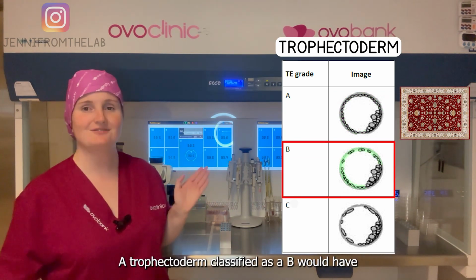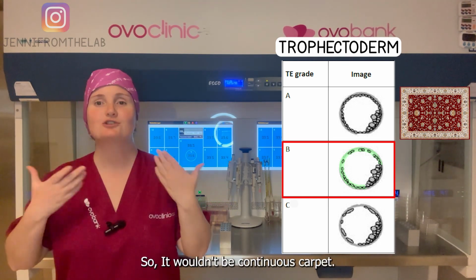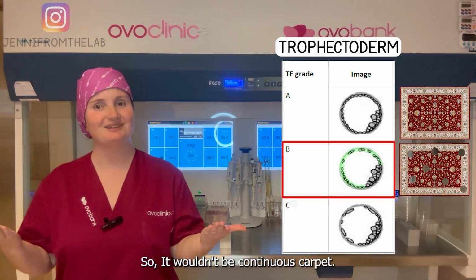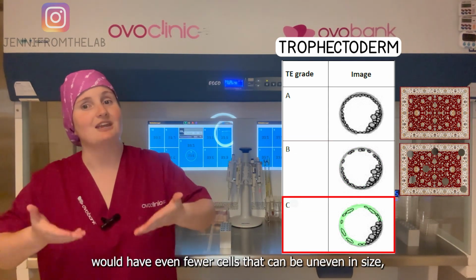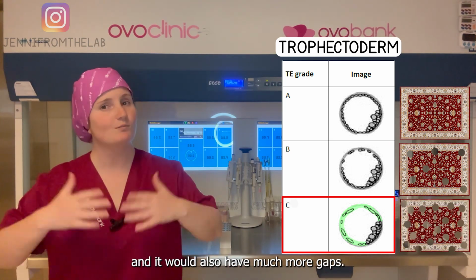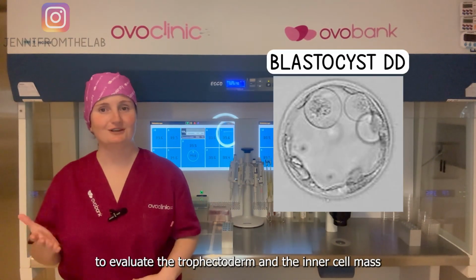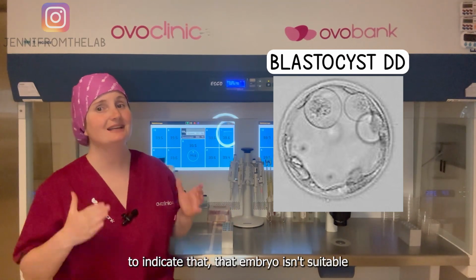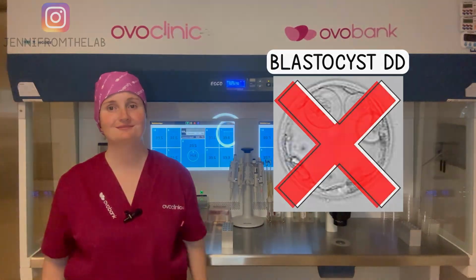A trophectoderm classified as a B would have fewer cells with some gaps, so it wouldn't be a continuous carpet. And a trophectoderm classified as a C would have even fewer cells that can be uneven in size, and it would also have many more gaps. Also, there are some clinics that include letter D to evaluate the trophectoderm and the inner cell mass to indicate that that embryo isn't suitable and that it will be discarded.